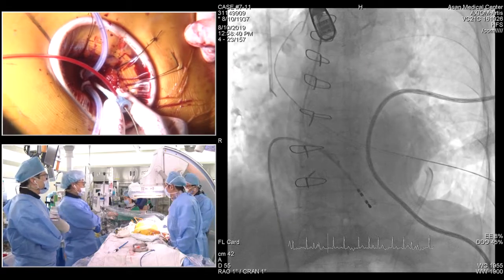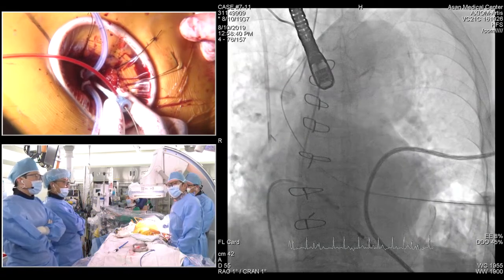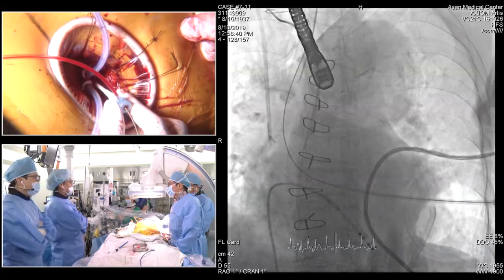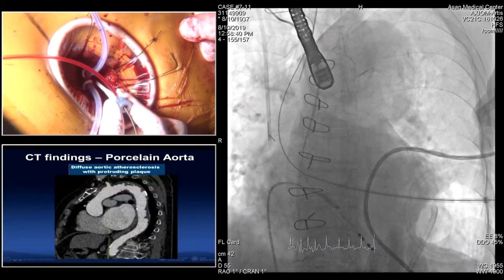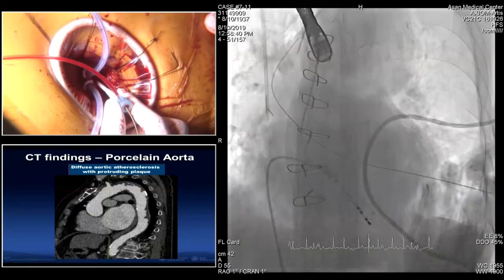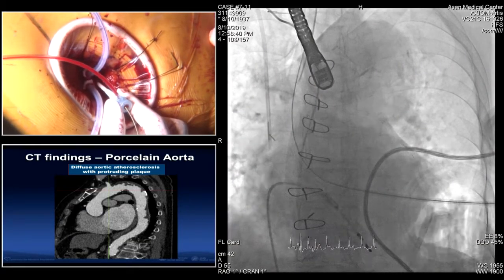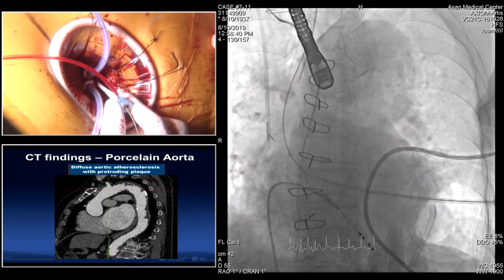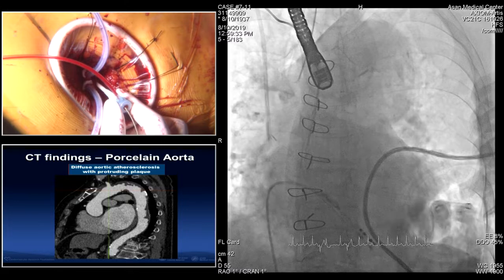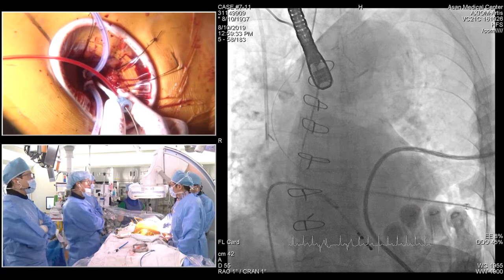Could you show us the slide? We have a comment. Yes, okay, I can just address that question. So actually we did consider the trans-aortic approach through the ascending aorta, but in reviewing the CT, the saphenous vein graft seemed to be a little bit high and in close proximity to where we would puncture the aorta, plus the fact that this patient is a redo, and this also being a live case, we didn't want to expect any surprises. So we felt that in this case, the transapical approach would be safer.